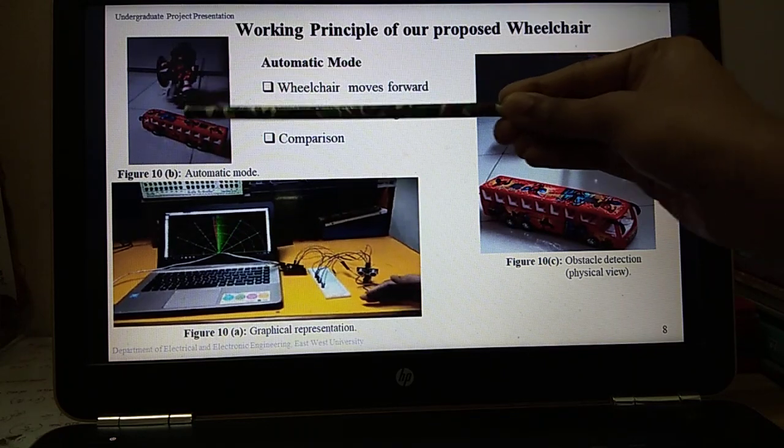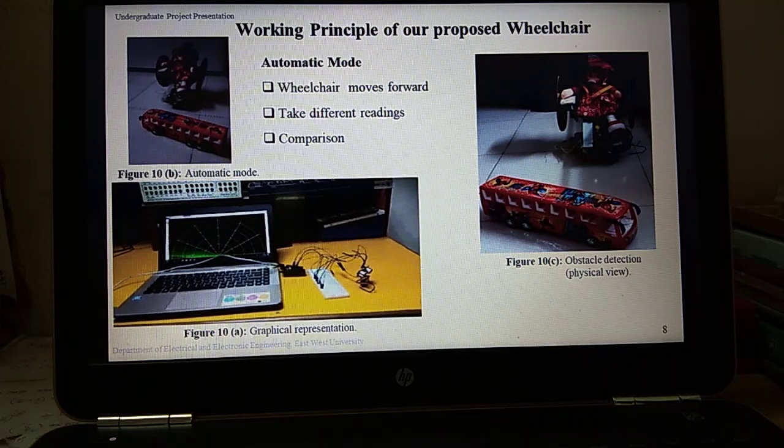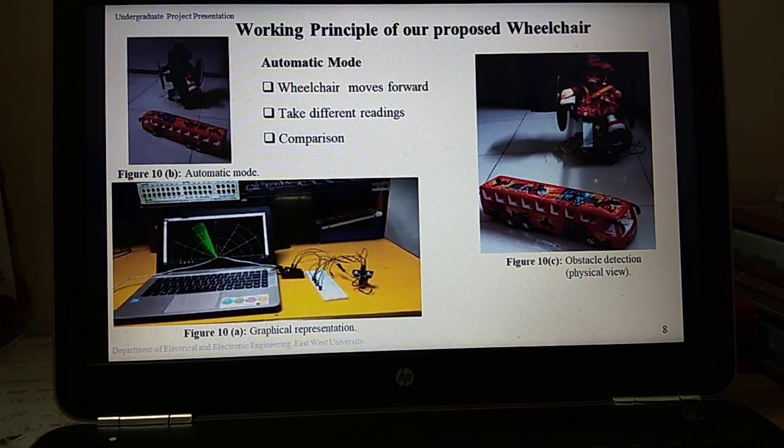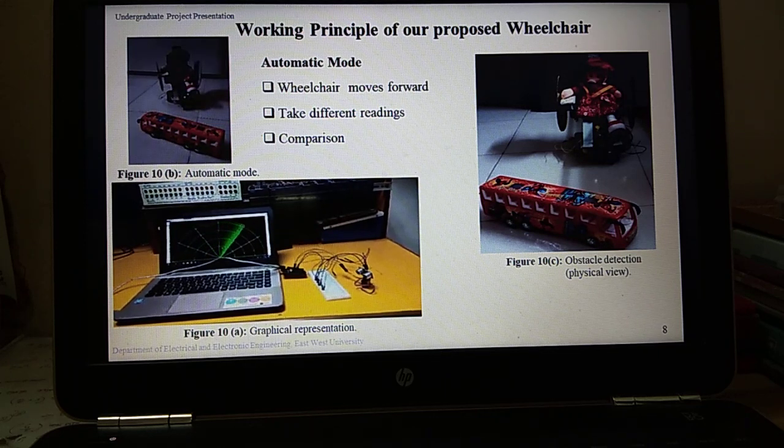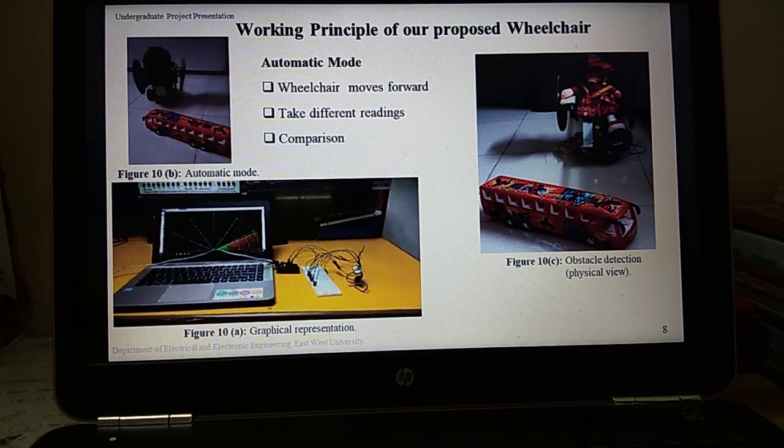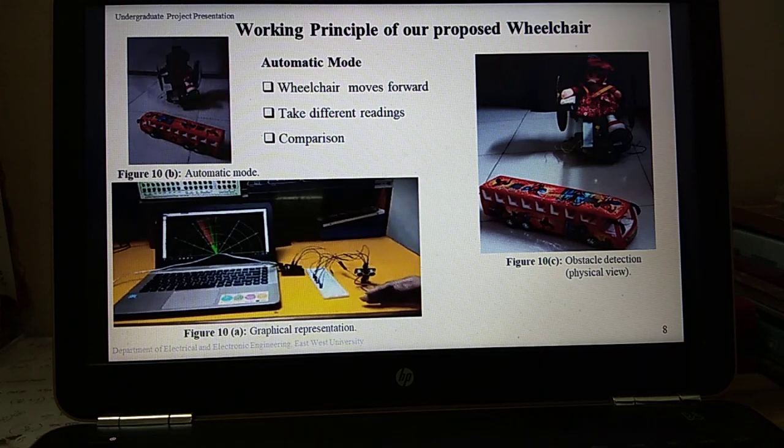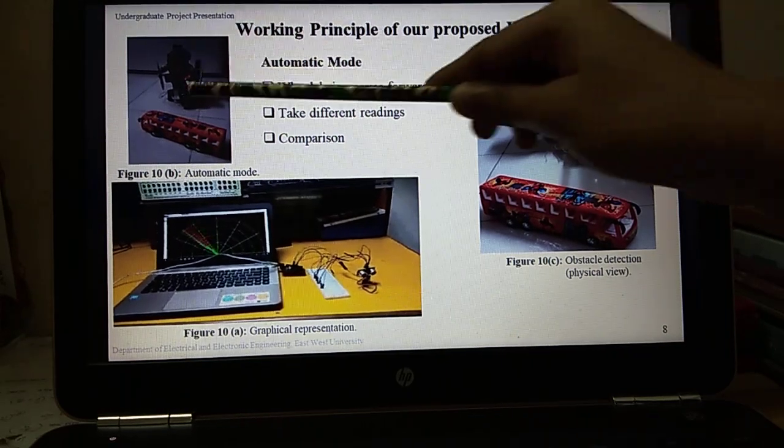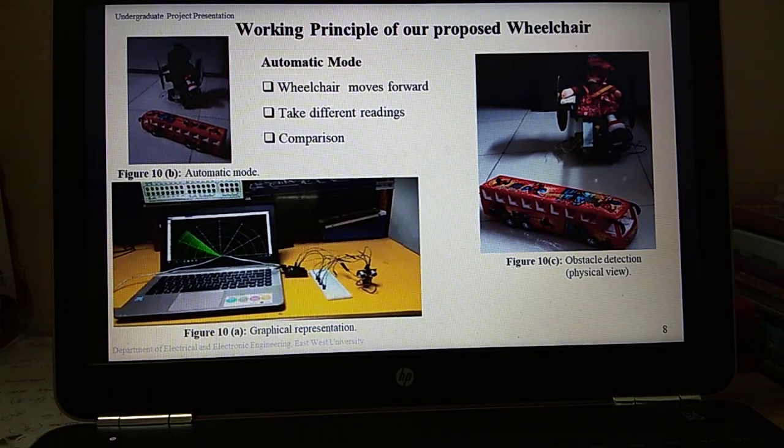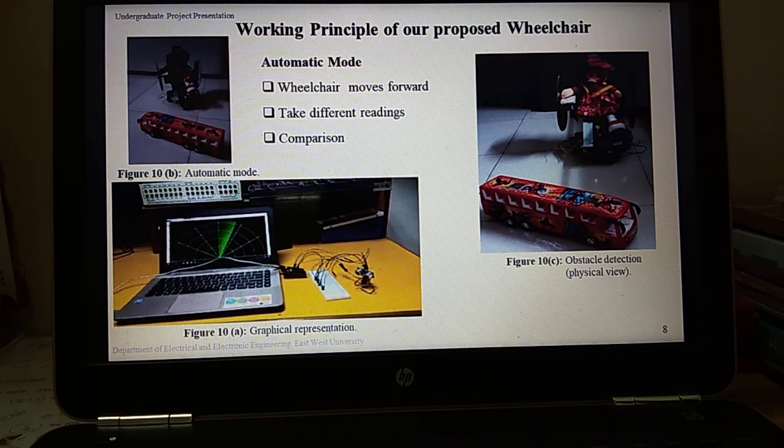When I switch on the prototype, both motors will run and it moves forward. During this time, the ultrasonic sensor continuously calculates the distance between the wheelchair and the obstacles in front of it. If the distance between the wheelchair and the obstacle is less than 30 centimeters, it will stop moving and rotate the sensor using servo motor to take readings at different angles. Here the reading from the sensor is less than 30 centimeters. For that reason, the wheelchair stopped moving forward and started taking different readings by tilting the servo.